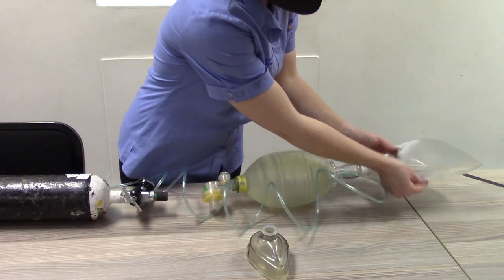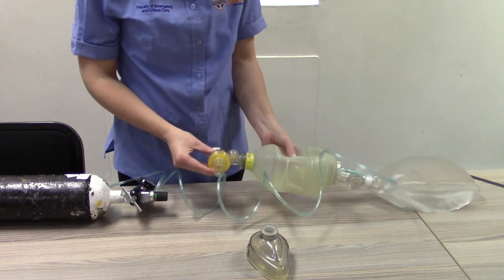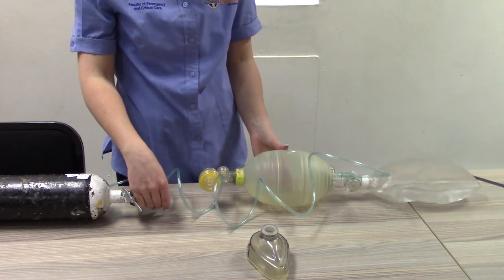Compress the ventilation bag and ensure that the reservoir re-inflates with no air leaks.